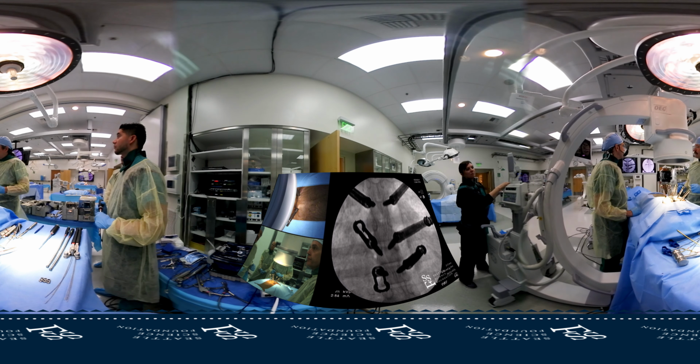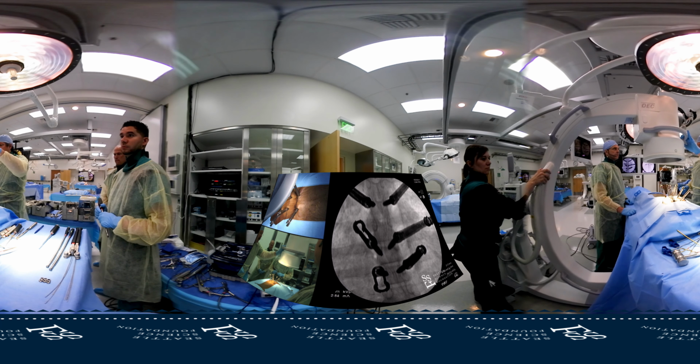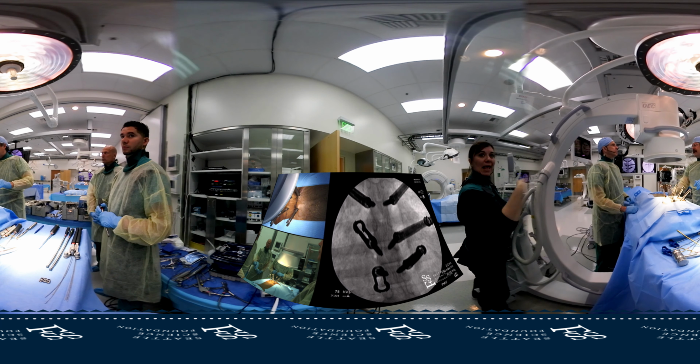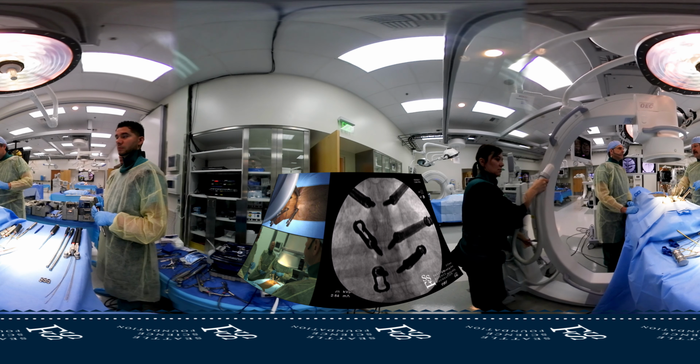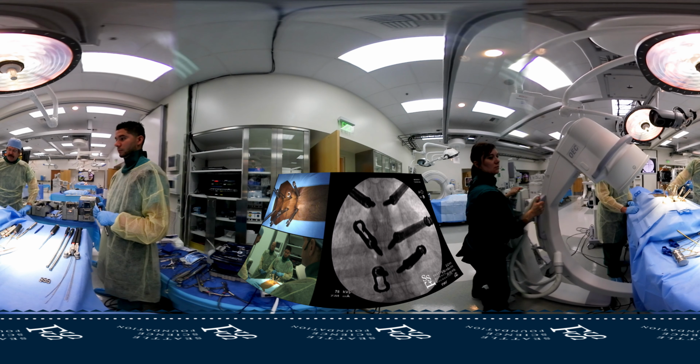John, let me ask you a question. Yeah. So neurostim, motors, what do you do for these cases? I use SSEP and motor monitoring for all of them. Can you stimulate those screws? Have you done that? I don't stimulate the screws.